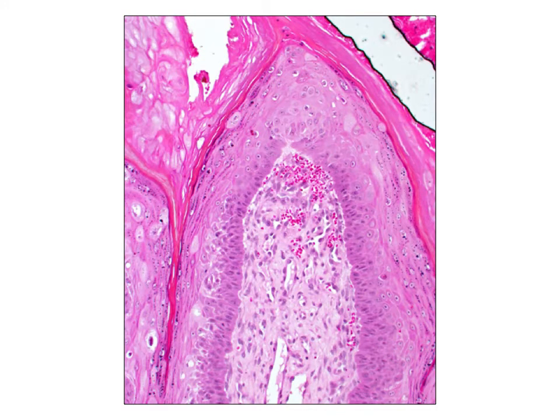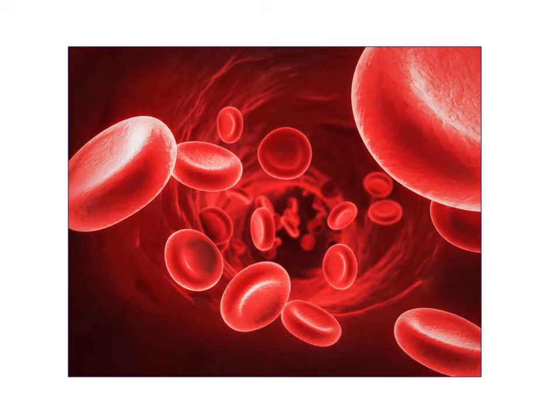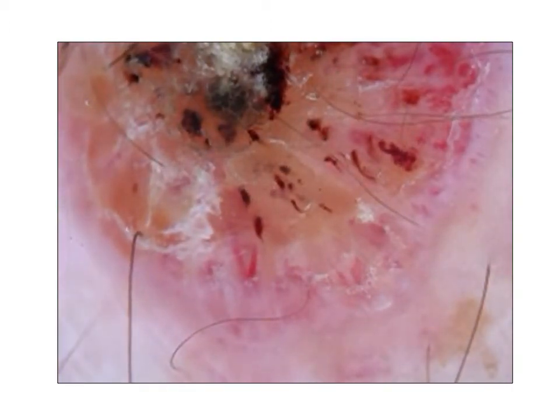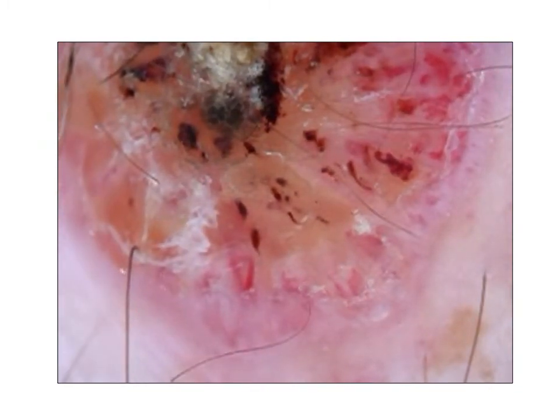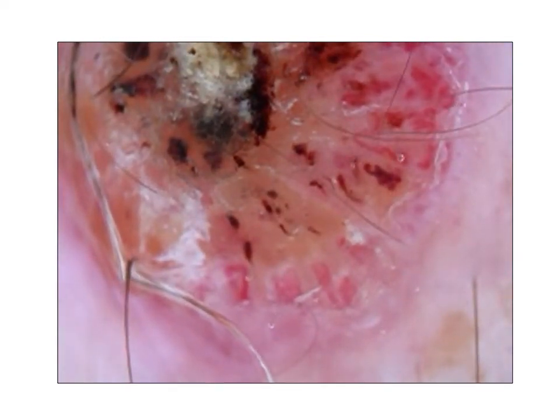First of all, what we are going to see are vessels. Vessels are present in the vicinity of the tumor, and the peculiar behavior of the vessels in the area of squamous cell carcinoma is interesting to consider. What we see are red blood cells inside the vessels, so it is important not to put too much pressure. Too much pressure will erase the vascular structure, whereas with less pressure, you will see them better. So a non-contact dermoscopy could be used, or gel dermoscopy is also interesting.